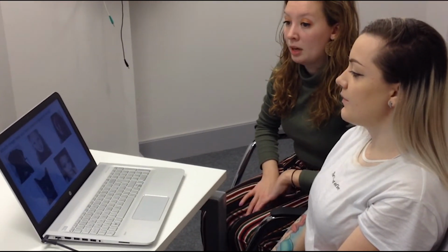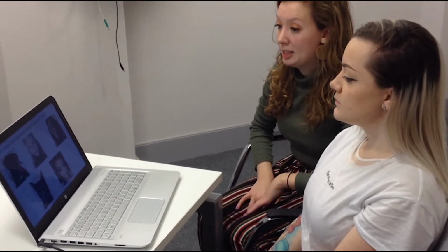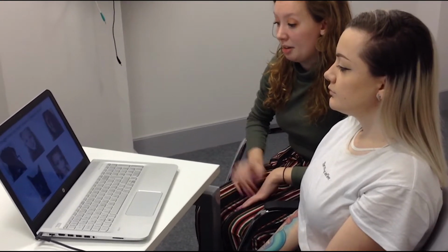Okay. So to end the experiment, the participant will once again be asked to identify the image they were asked to keep in mind. This is to ensure they were focusing on the correct relevant image for the researcher to analyse the data accurately.